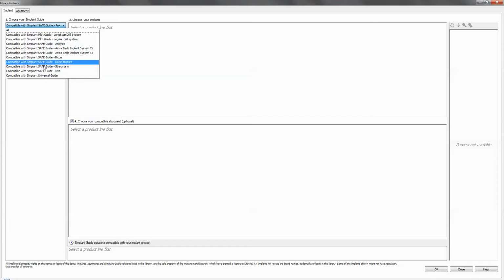The meaning of safe generally means it's a fully guided surgery guide. This generally means you also need a guided surgery kit of these relevant implant systems. Each kit is different from each other, so it becomes a very costly investment. If you're not too bothered about having a fully guided workflow, you can opt in to just get an Implant Pilot Guide. There are two types.